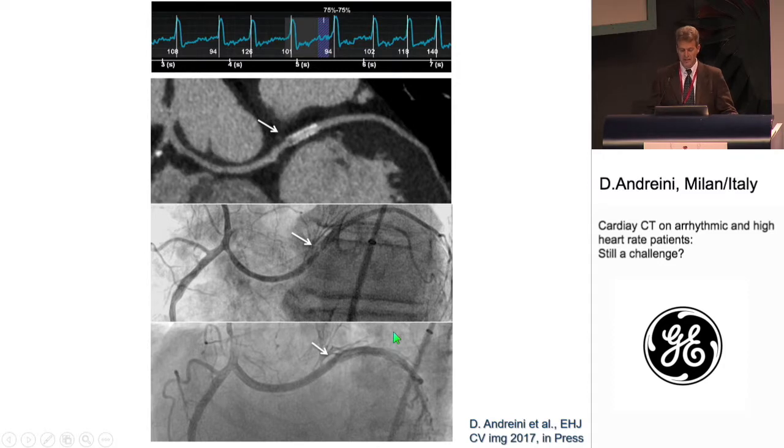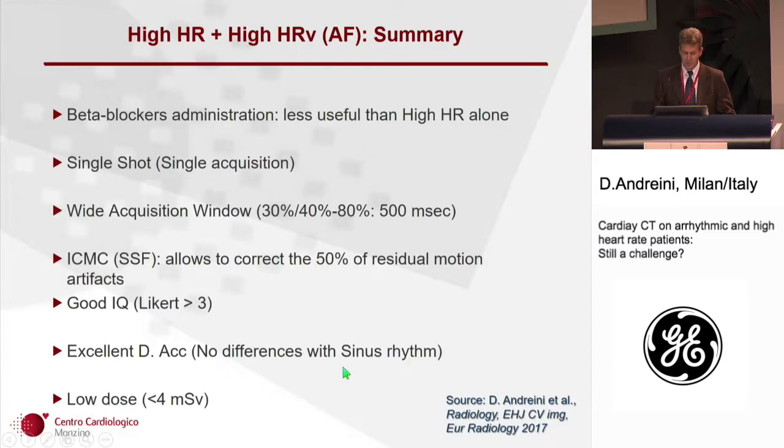So the final case, again, the coexistence of stent and atrial fibrillation in this anomalous circ from the right, the detection of this significant ISR of stent confirmed and again treated by the invasive procedure.